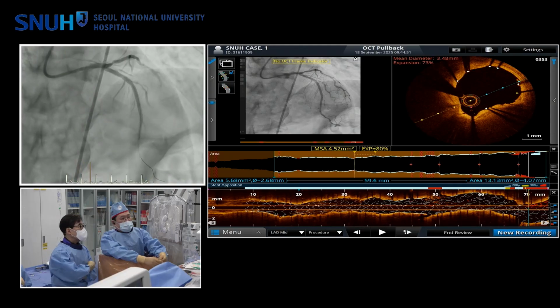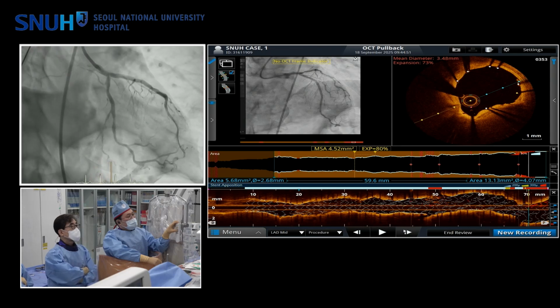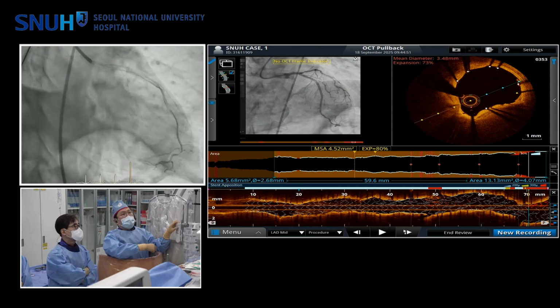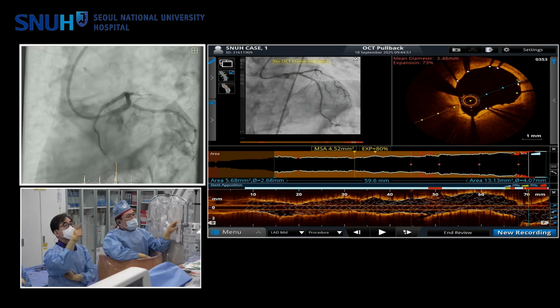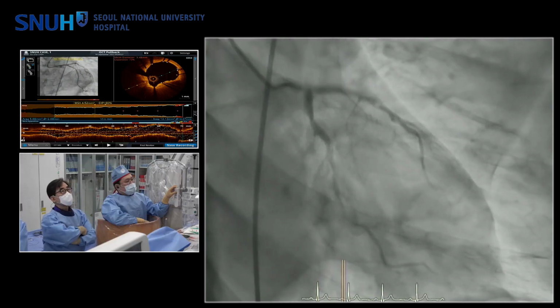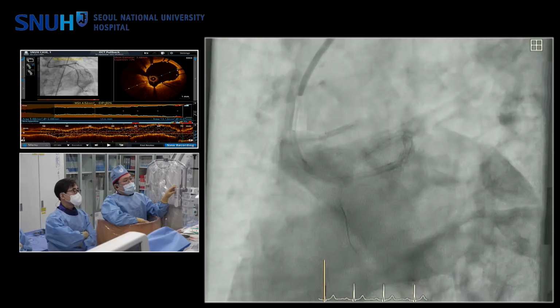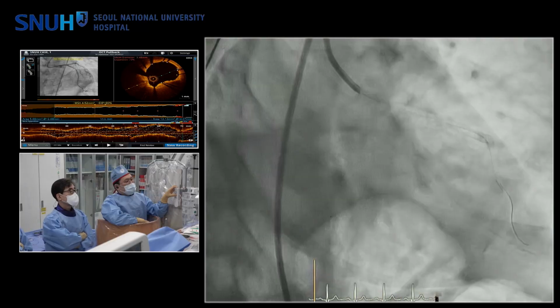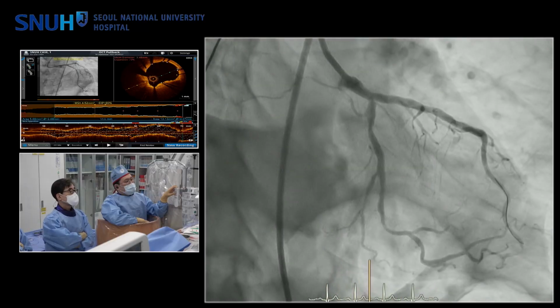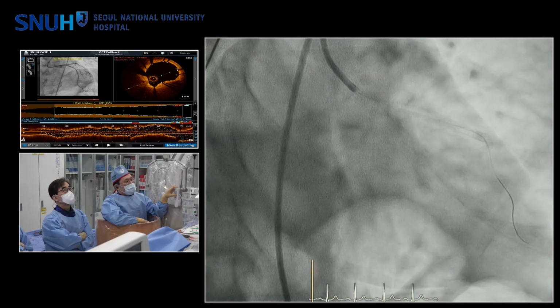Can we say it's clinically not important until you come back? The problem is, if you have an area of malapposition, two things can happen when you come back: the guide catheter can damage the stent, or you can wire under the stent if you have to do a further intervention. So certainly I would POT in this area at low pressure to try and get apposition.